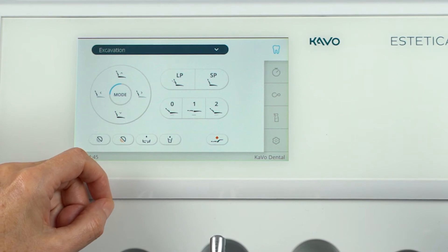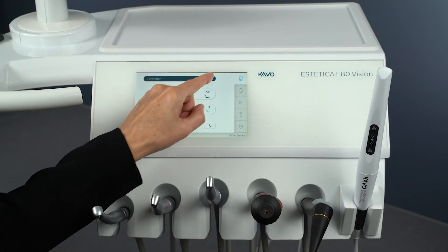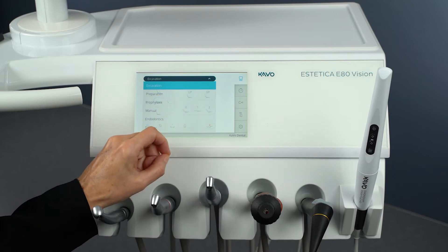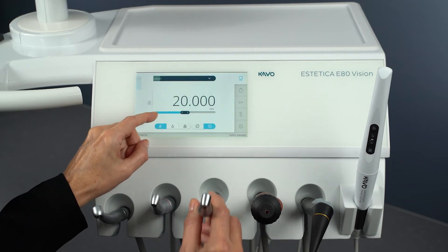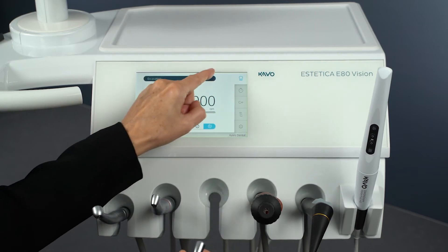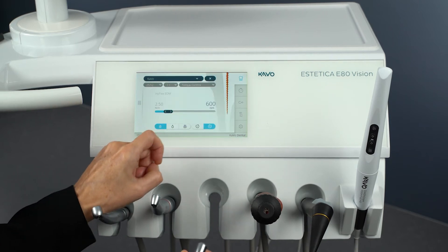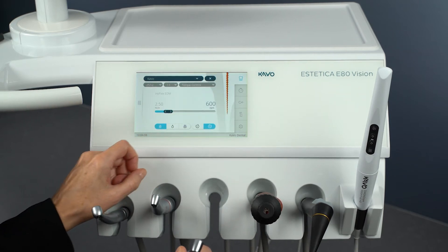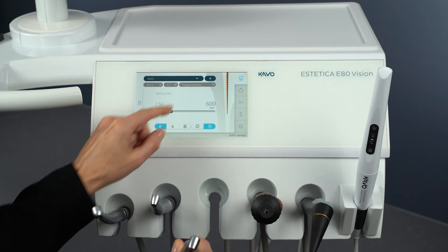Use the Back button to return to the Treatment menu. To set the parameters for the Endodontics workflow, remove the motor from the tray. Select the treatment type Endodontics from the selection list. The display on the treatment unit's touch display changes to the Endodontics treatment type.